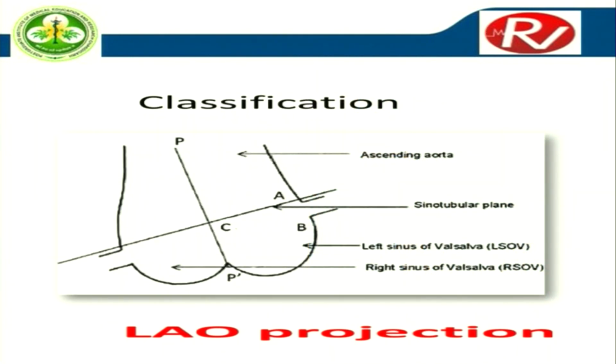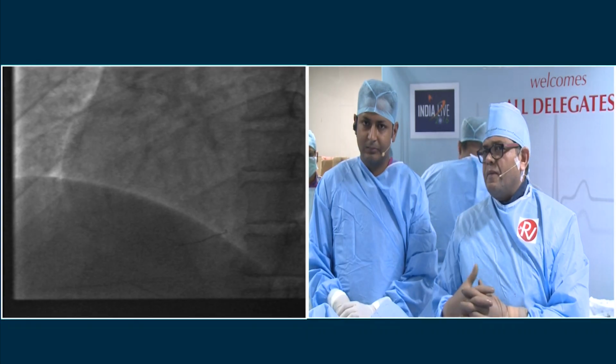Dr. Ajit Mullasri's paper in the Indian Heart Journal is about the types of anomalous RCA origin from the left coronary sinus, which can be type A, B, or C, depending on the origin of the right coronary artery. And here we have type C anomalous RCA, which is arising from the mid part of the left coronary sinus. Next slide, please.